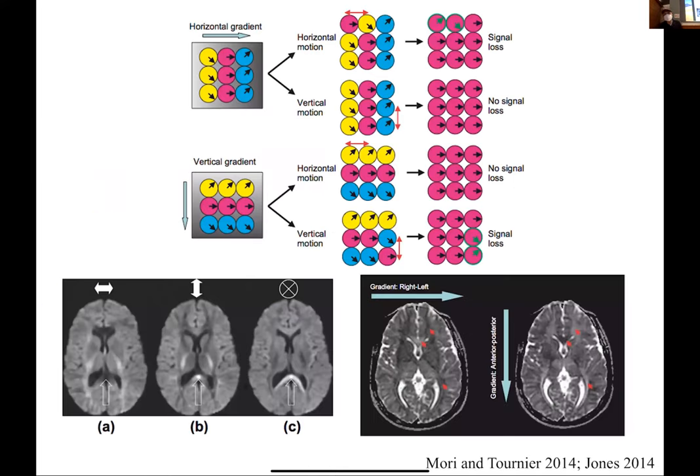So how do we measure diffusion in different directions? The cool thing is we can do that with magnetic gradients. If I apply a gradient where the field varies this way, then I'm only going to be sensitive to diffusion of particles moving in this direction. I'm only sensitive to this direction of diffusion, because that's the only direction in which I'm varying the magnetic field. Along the other direction, there's no difference in magnetic field, so the MRI is not going to be sensitive to that. If I want to be sensitive to this direction, I apply a magnetic field gradient along this direction. And if I can do it in that direction, obviously I can do it in any direction. So in diffusion imaging, we apply gradients in different directions to be sensitized to diffusion along different axes.